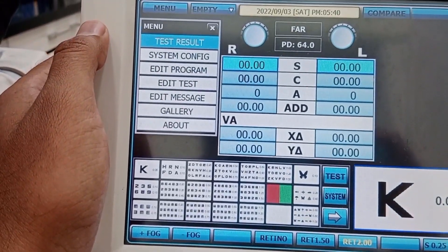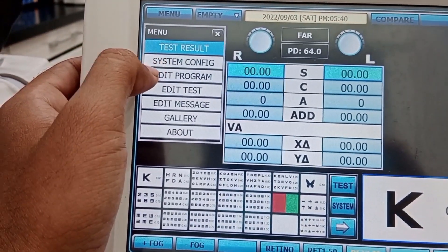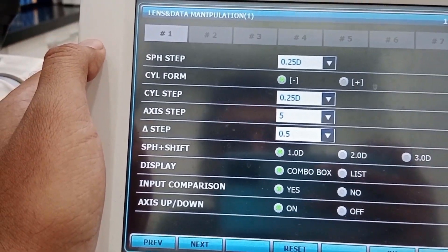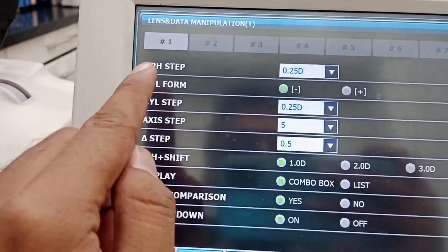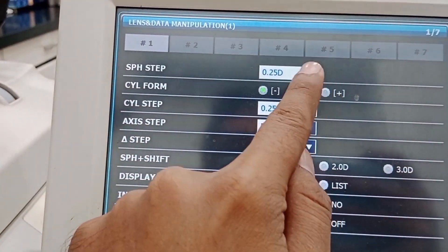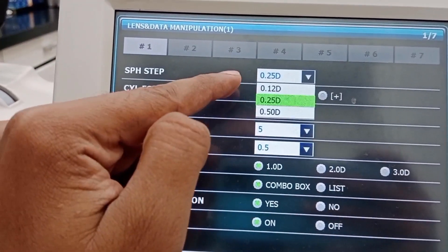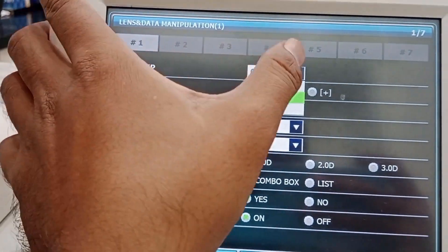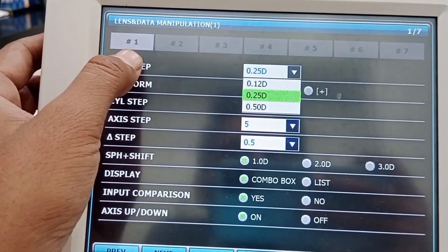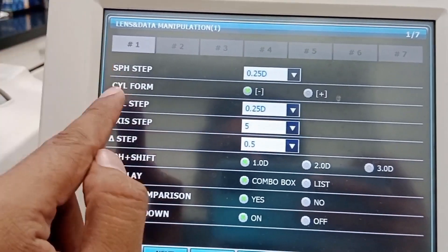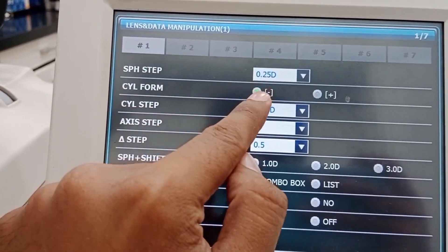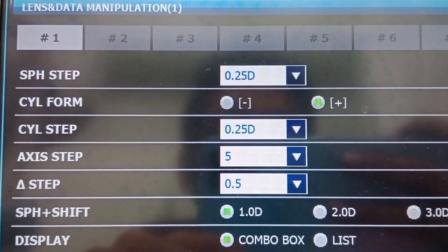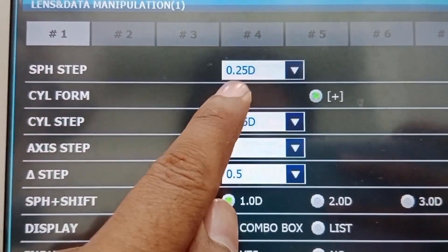The next one is system configuration, which is important. If I press it, you can see the spherical step — with one click you want to shift with 0.12 diopter, 0.25 diopter, or 0.5 diopters. It is settled on 0.25 diopter with one click. The next one is cylindrical form — you want the cylinder in minus form or in plus form.